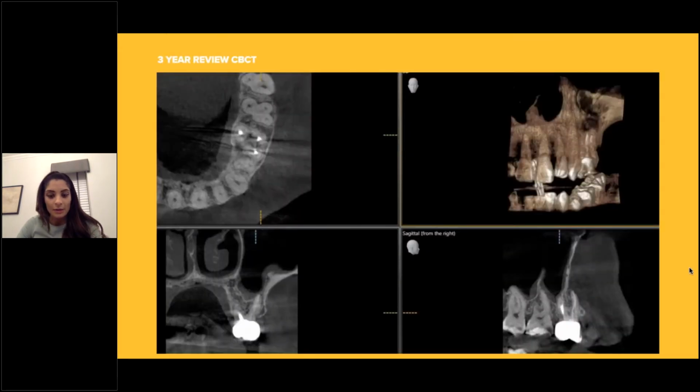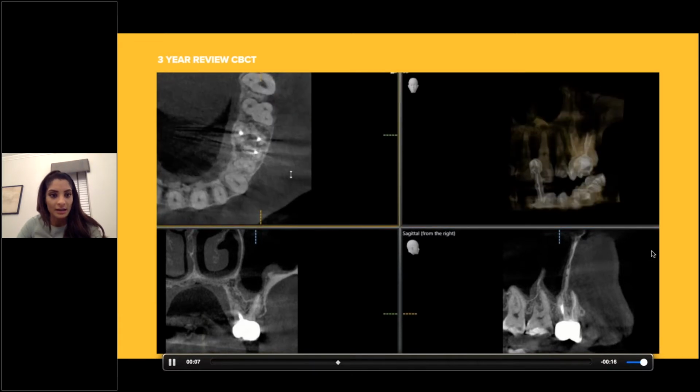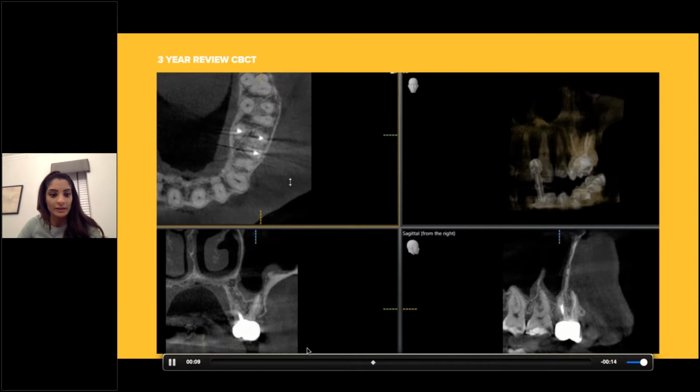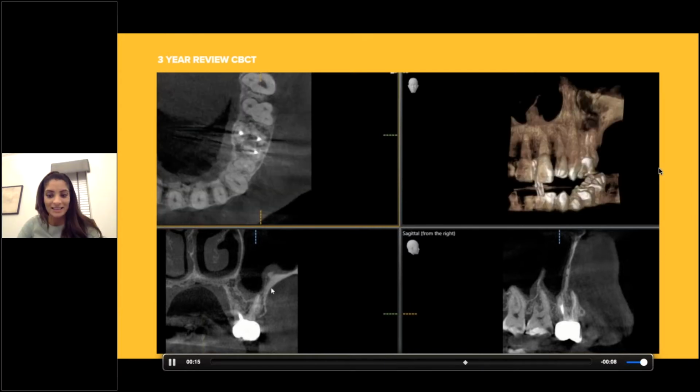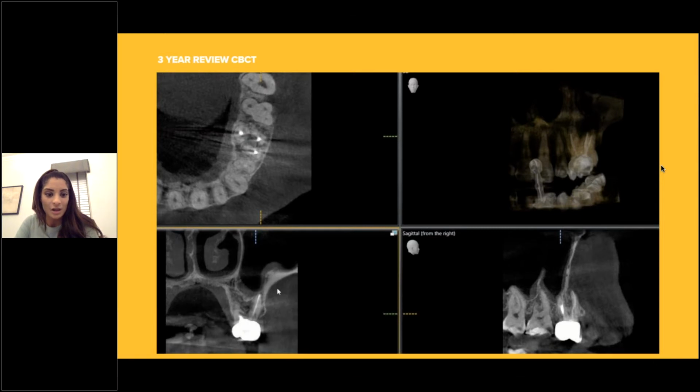This is his post-operative CBCT. So you can see on here, we've got bone directly onto the perforation repair. As I scroll up here, we can see good bone in the furcation. And even on this view down here, we can see that the bone has grown almost directly onto the Biodentine repair. So we got very fortunate in this case. Things worked well, but I think that there's no other material really that you can mend a perforation that size with apart from something like Biodentine.